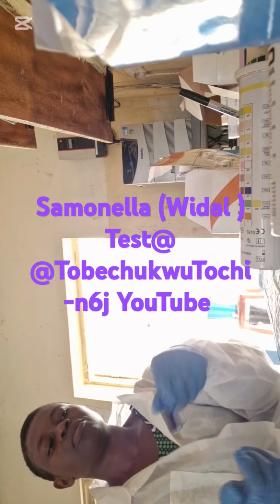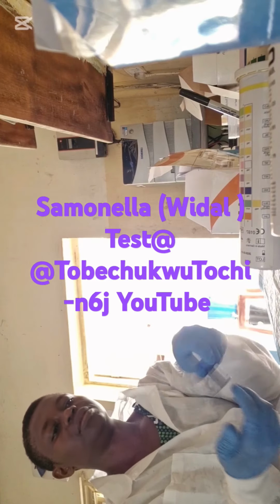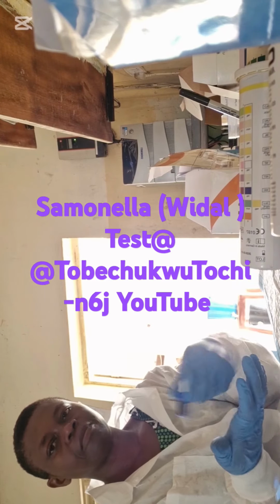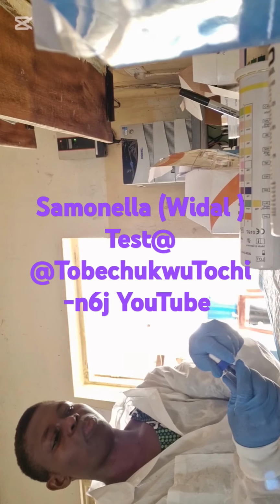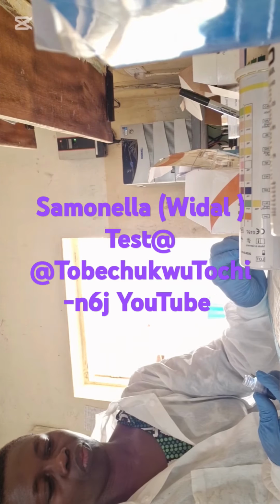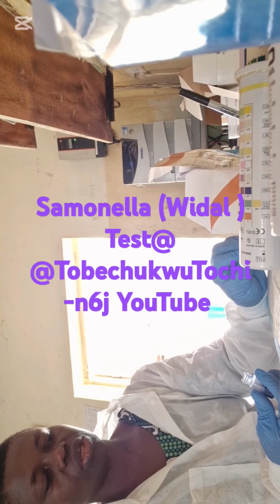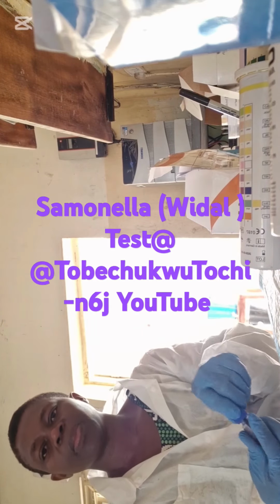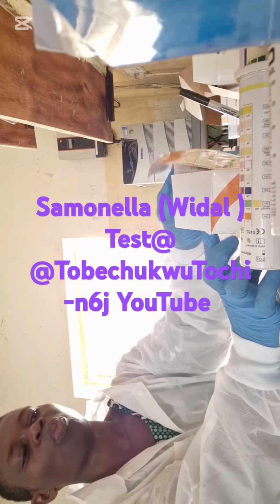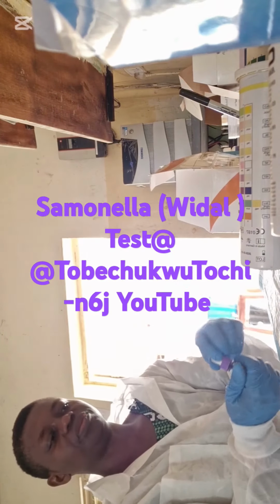This test shows whether someone is infected by the typhoid bacteria, which passes through the small intestine via the lymphatic system to the mesenteric gland. For this test, you see, I'm adding this anti-sera one by one to the different eight holes.